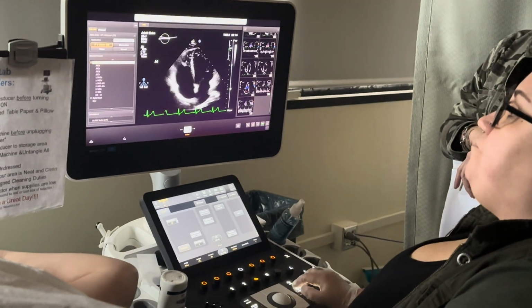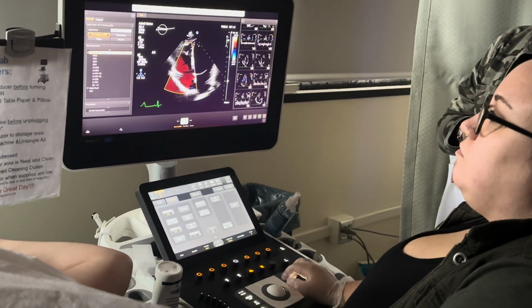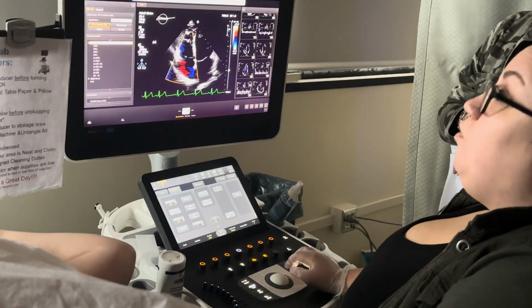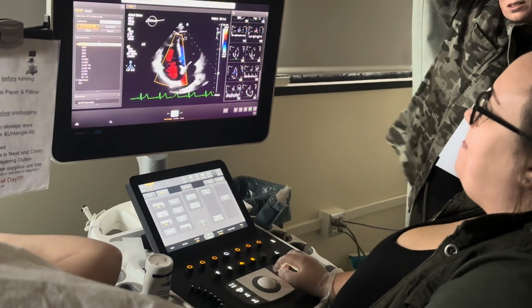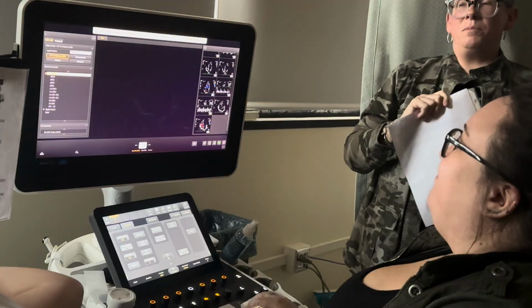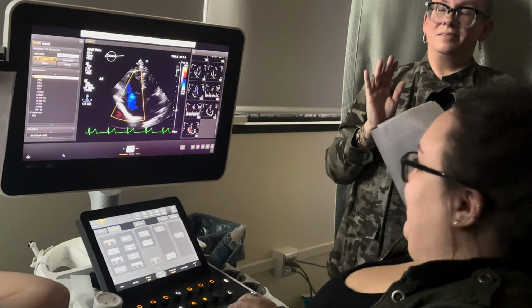In the real world, would you get the better picture and then move to spectral, or is it just the spectral picture with the B mode and color? You want all of them to be good on their own no matter what. Yes. So for us, our doctors like color compare because they're already looking at 100 images, and they want to minimize.